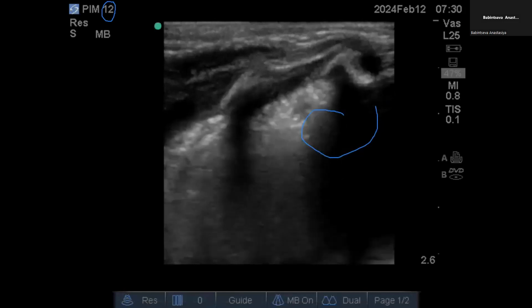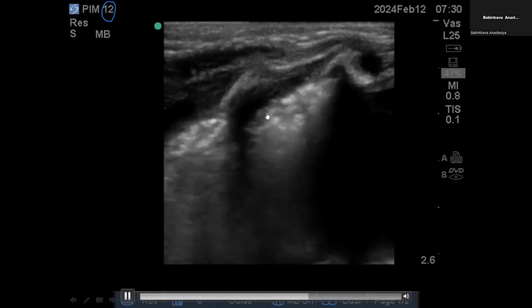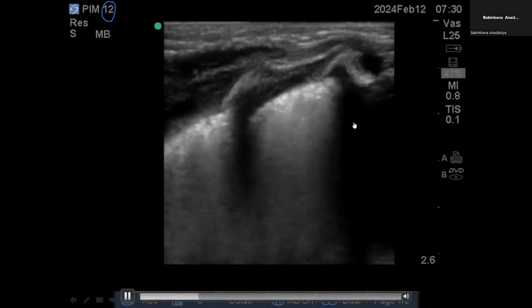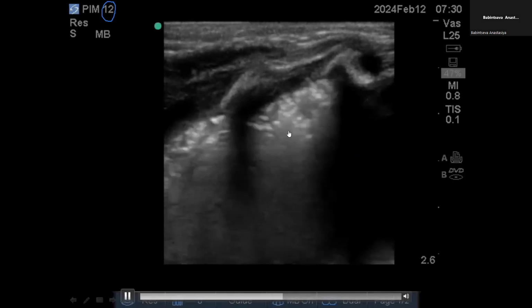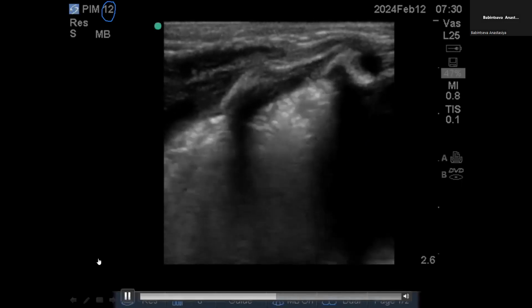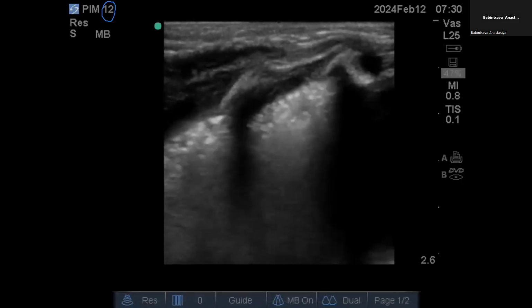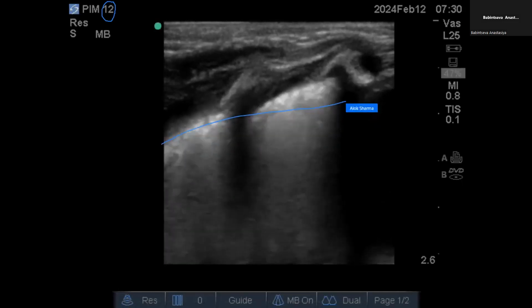And this is L1. Can you see the atelectasis? Beautiful. Can we describe it as bronchograms? No. So what you've got is a beautiful image. The baby is basically easy on the ventilator at the moment. So you have inspiration, expiration. When air goes in, in the inspiratory phase, the pleural line gets established. Then when he expires, you basically have atelectasis.